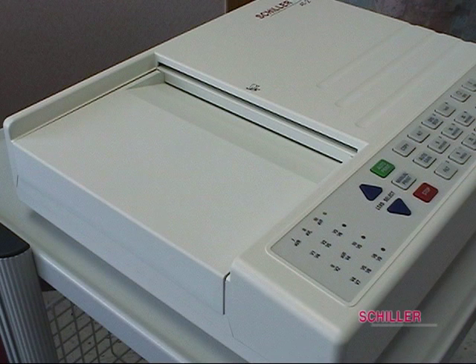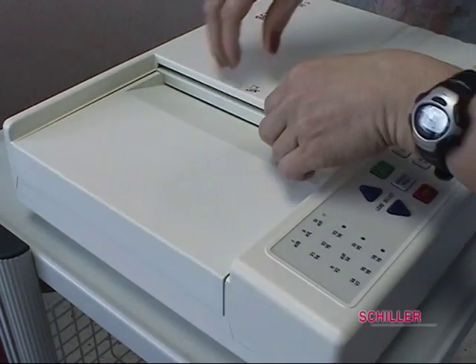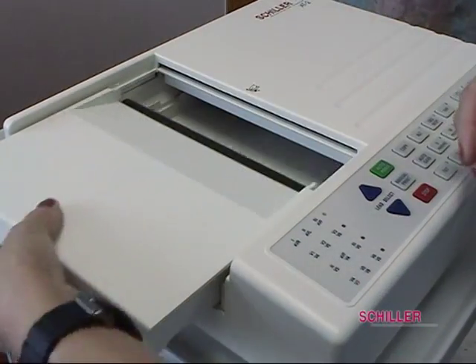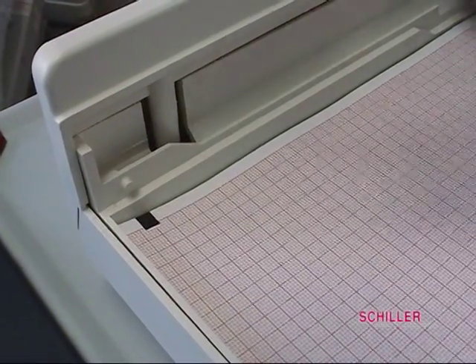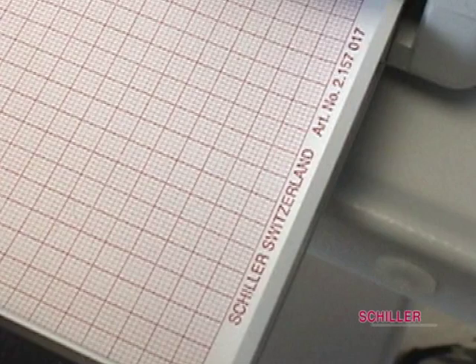Pop the tray by locating the latch indicated by the hand icon and pressing until you hear a click. The tray will release, allowing you access to the paper. Orient the paper with the black square at the top and the Schiller name with the part number at the bottom of the paper.